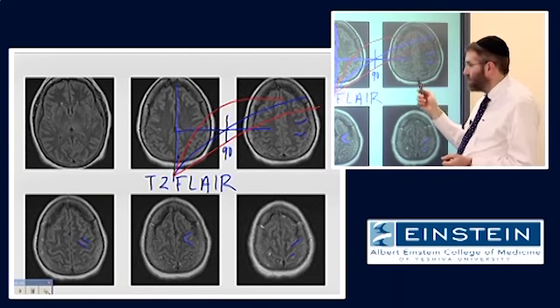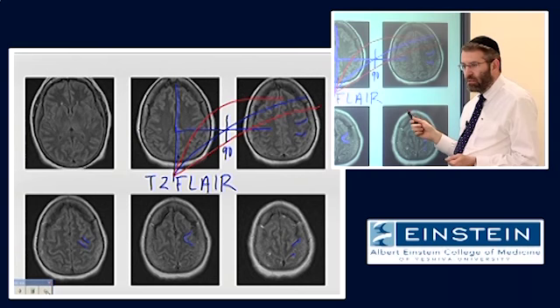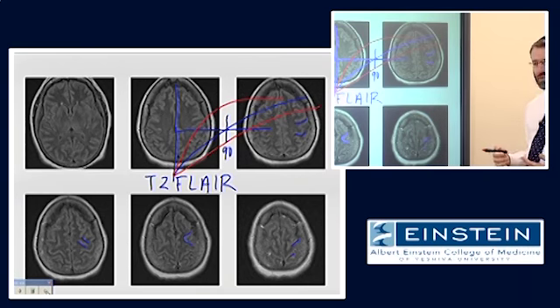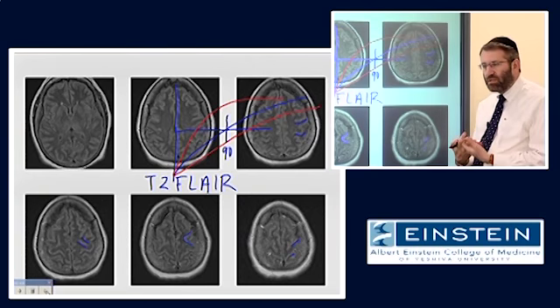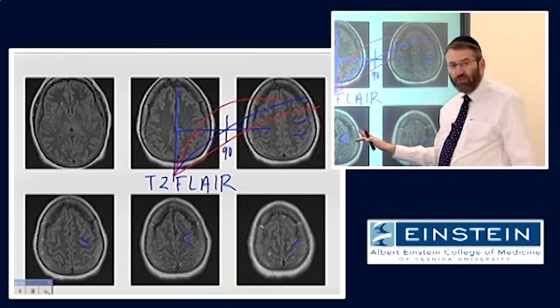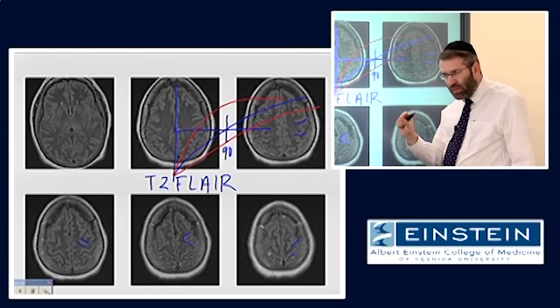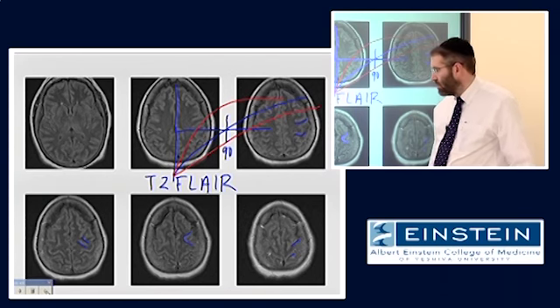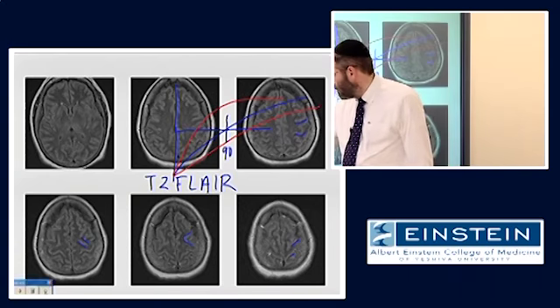So this actually is a patient with subarachnoid hemorrhage, which typically has been thought of as something that you really don't see very well on MR images, that we're not very sensitive to it. It turns out that using FLAIR, you're exquisitely sensitive to the presence of subarachnoid hemorrhage. Because when there's anything in the fluid, anything in the CSF, that alters the T1, and all of a sudden, we don't suppress it. This is for the radiologist.